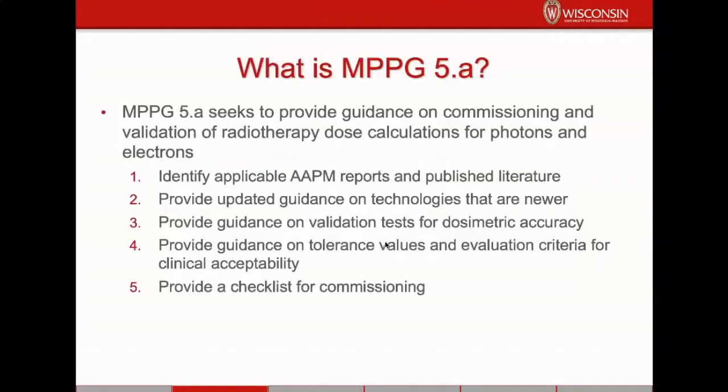So what is MPPG 5A? Well, MPPG 5A seeks to provide guidance on commissioning and validation of radiotherapy dose calculations for photon and electron beams.